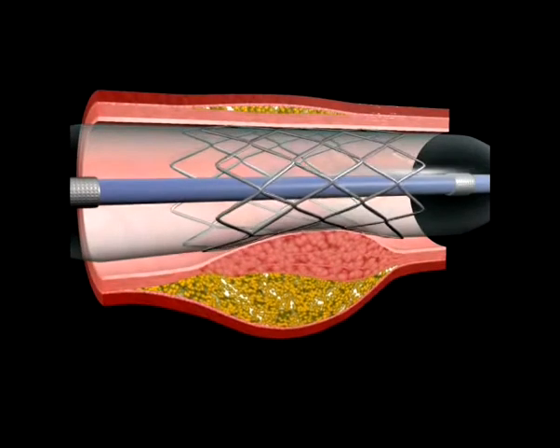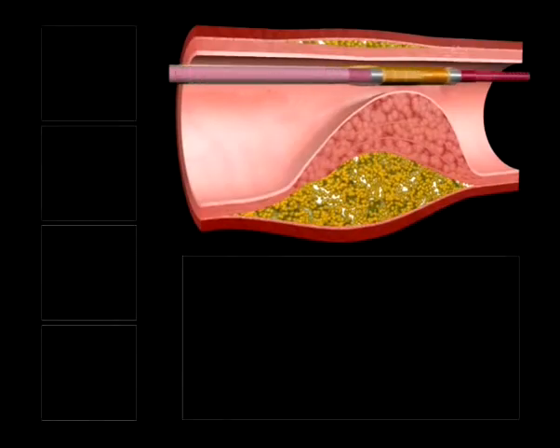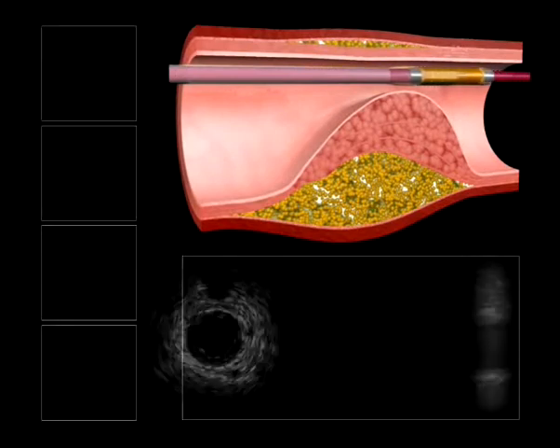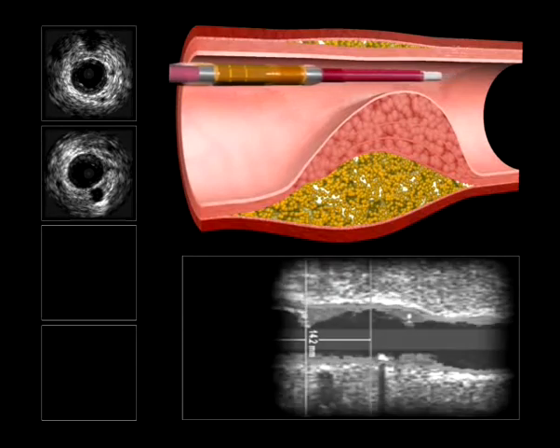A study has shown that using angiography alone to guide drug-eluting stent implantation leads to improper placement 67% of the time. Volcano IVUS provides clarity in your approach, allowing you to visualize the total vessel, not just the lumen. IVUS provides information that angiography alone cannot deliver.